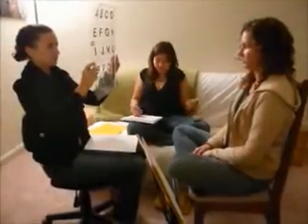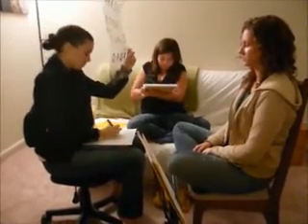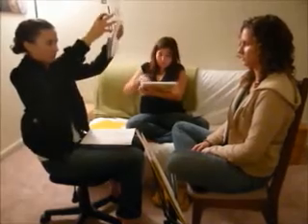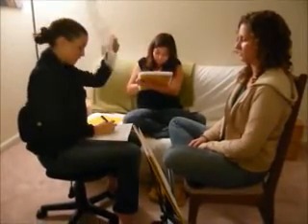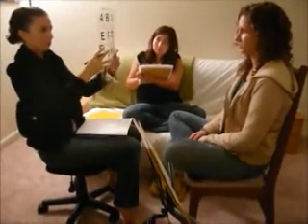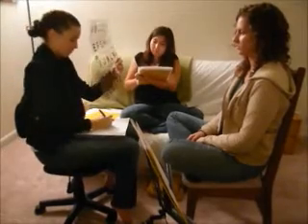The communication partner and user should be positioned opposite each other. Position the eye link between each other so that the letter A is on the left-hand side for the user. The communication partner holds the eye link with one hand on either side of the board. The partner and user should be able to see each other's eyes through the center circle on the board.